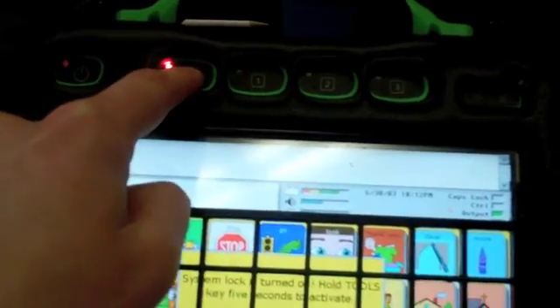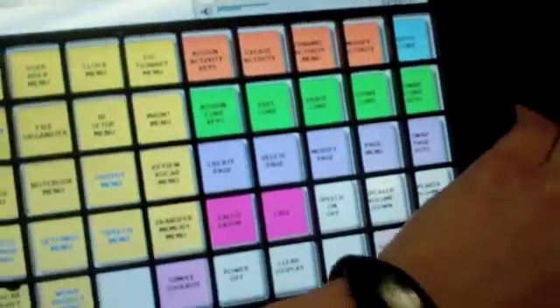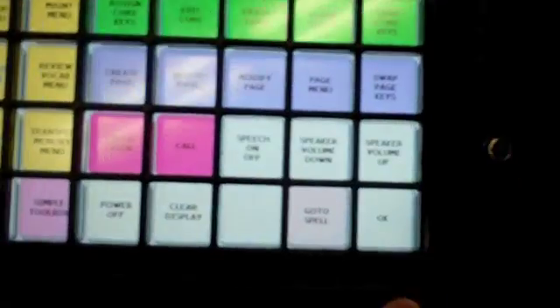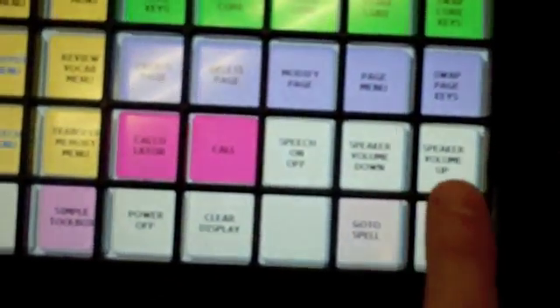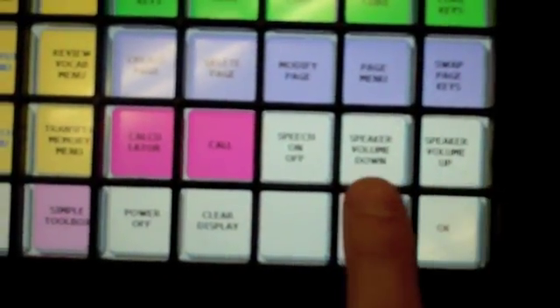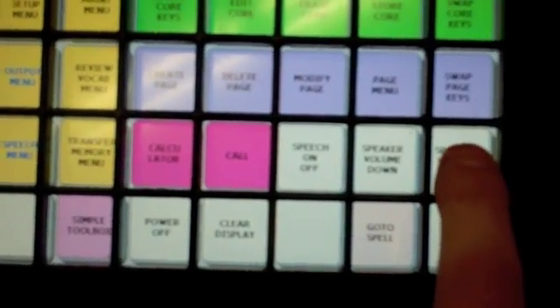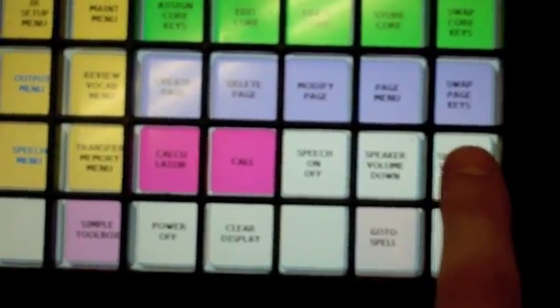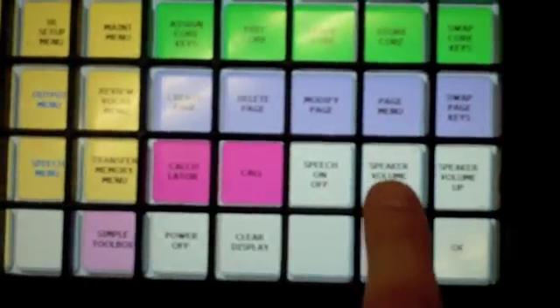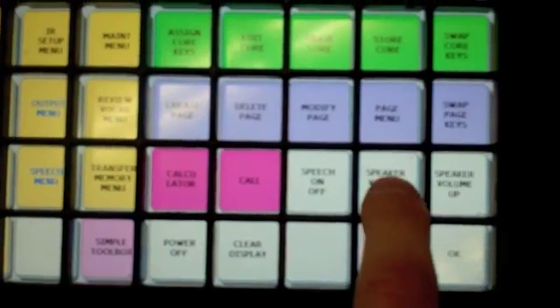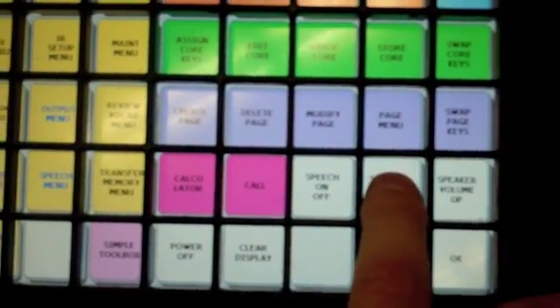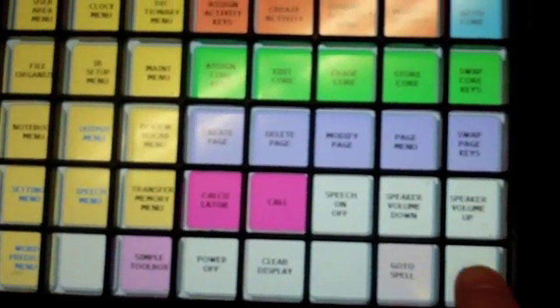And now in order to get the volume in the lower right-hand corner, there's a speaker volume up and a speaker volume down, and you press that to get up higher or lower. When you're done, you press okay.